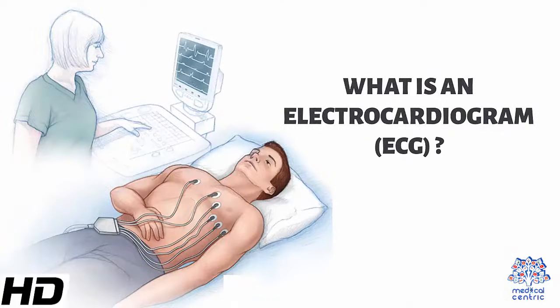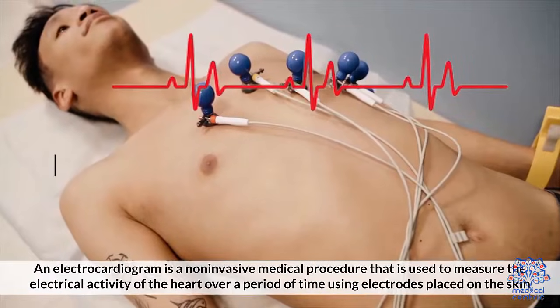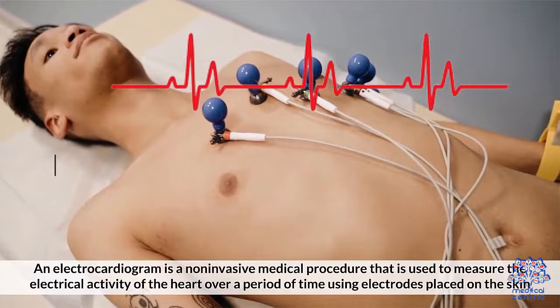Today's topic is: what is an electrocardiogram, ECG? An electrocardiogram is a non-invasive medical procedure that is used to measure the electrical activity of the heart over a period of time, using electrodes placed on the skin.